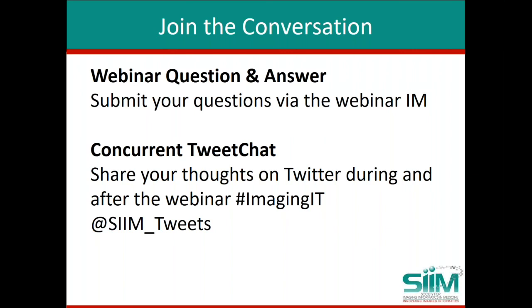Great. And Chris? Absolutely. The whole point of OHIF and Cornerstone is about integration, and it supports it at very fine levels of detail and at macro levels. You can do a very simple URL launch to launch a whole viewer. You can build your own custom web app to display an image in a viewport, and so it'll do everything. Obviously, the technology that we're using is web technology. So if the application you want to integrate with is web-based, it's far easier, but certainly possible with anything.